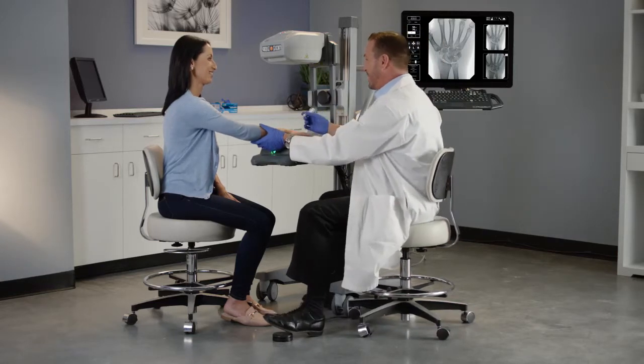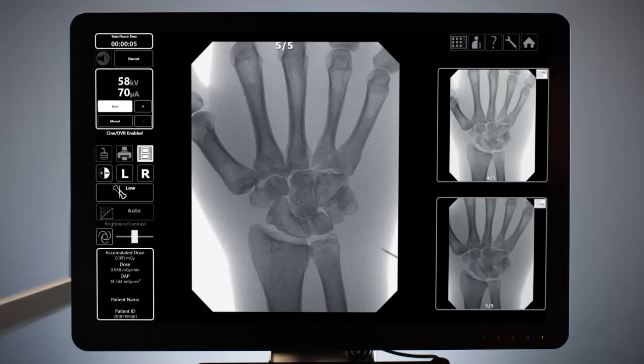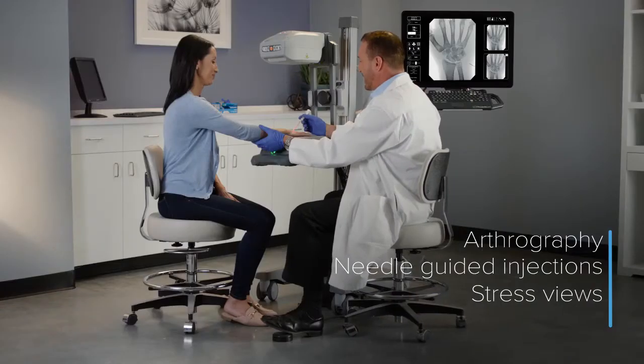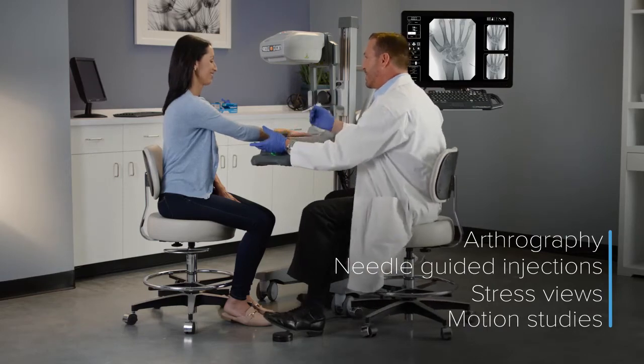With Mobile DI, fluoroscopy can be used in your office for additional diagnostic procedures, such as arthrography, needle-guided injections, stress views, and motion studies, which are accepted by Medicare for reimbursement.